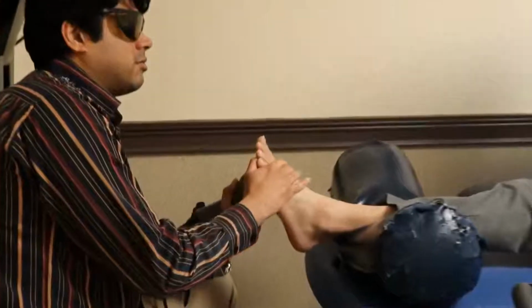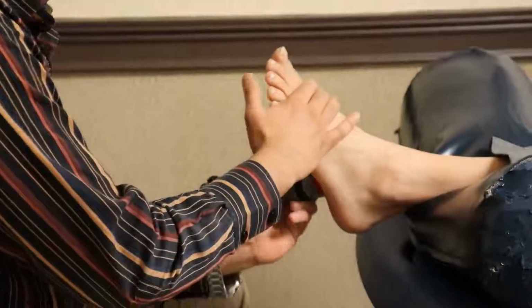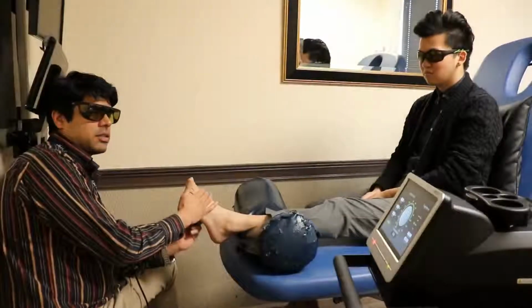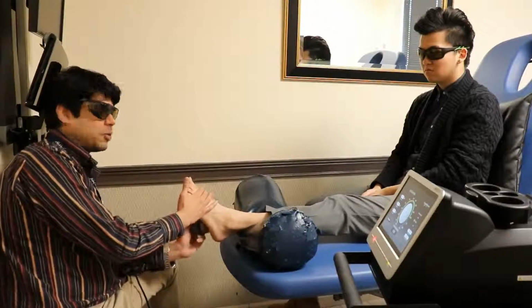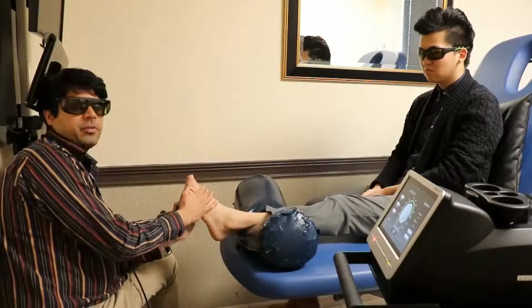How does it feel? Warm and soothing. There you go. That's the key, as long as you feel that. It shouldn't be a burn, it shouldn't be too intense, because then we're looking at potentially causing complications we should not want to deal with. If it's not warm enough, then it's not going to do enough for you. So as I said, warm and soothing is the operative word over here.